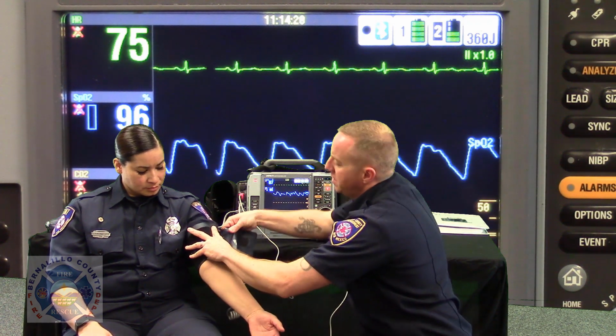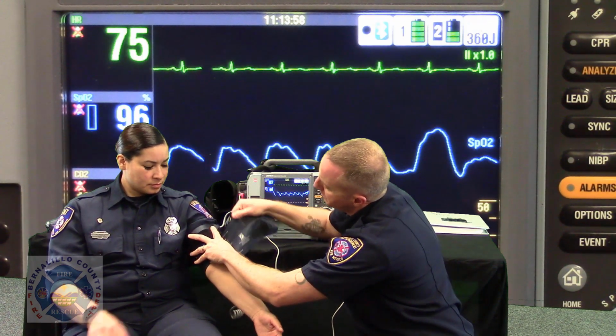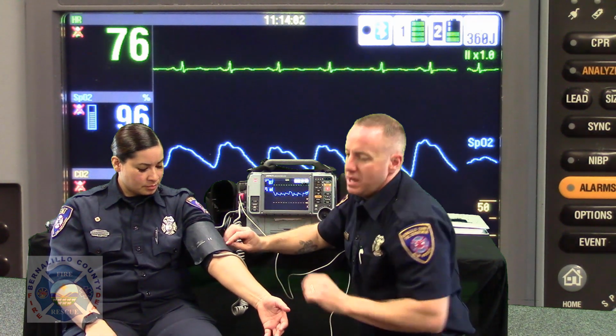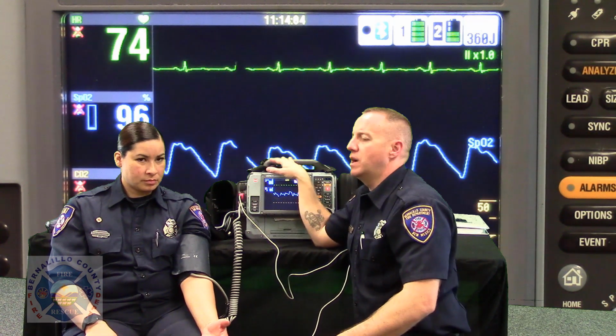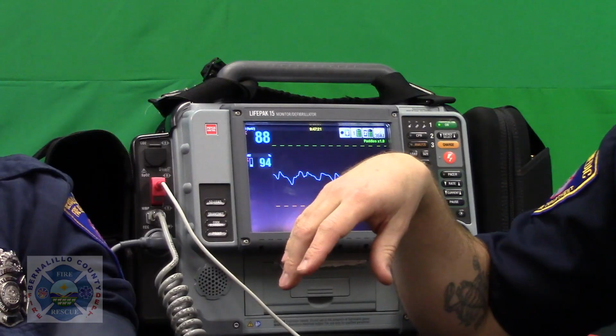Now as I come around, I can see my index line and my range, and I can see that my patient's range is going to fall right into that. If it steps outside of that range, we're going to escalate the cuff to the large adult, and if it's smaller than that, we're going to go to the small.